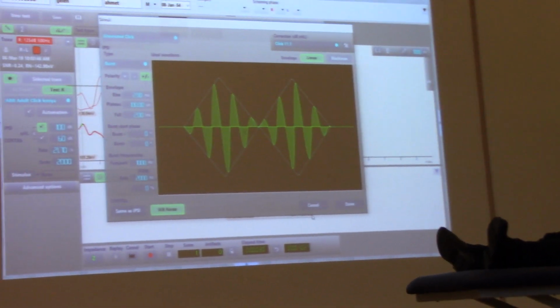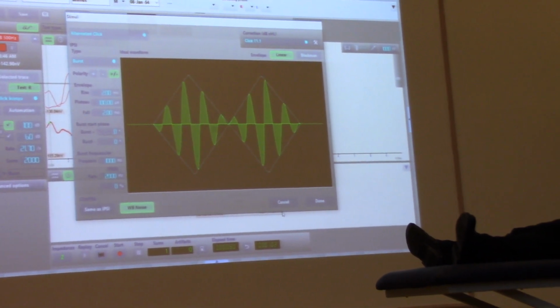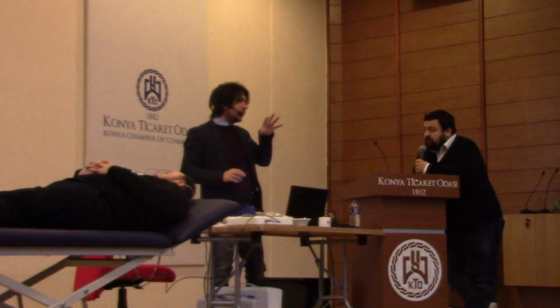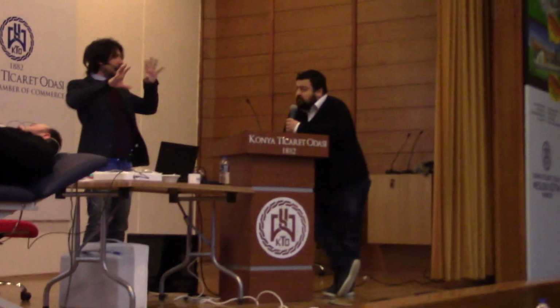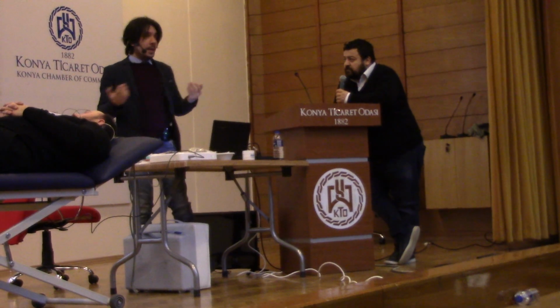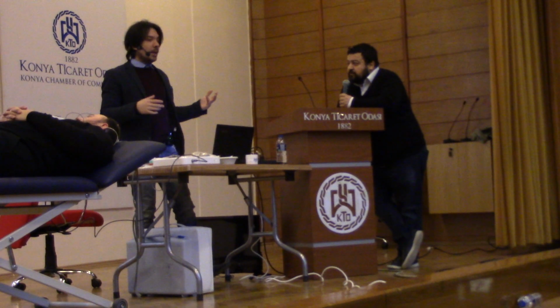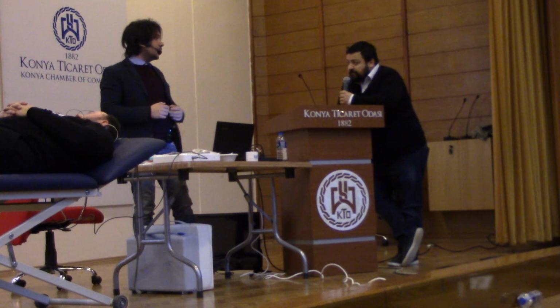You can change the frequency. Typically the usage of tone burst is to perform a threshold for each frequency and give you the value of objective threshold for each frequency, and then matching, for instance, 500, 1000, 2000, 4000 according to the patient and the audiometry that you tested, and get an accurate spectrum of the working hearing cells in the patient, and also the brainstem activity among all the frequencies response.